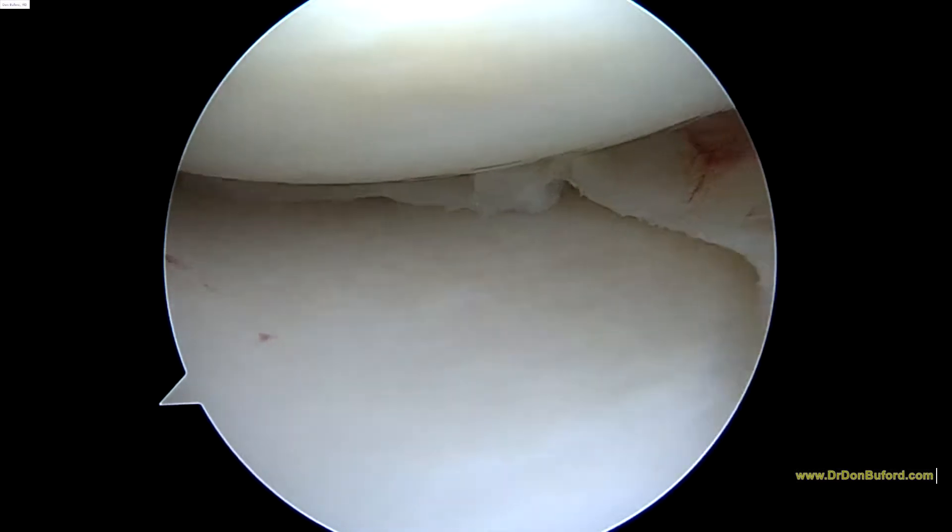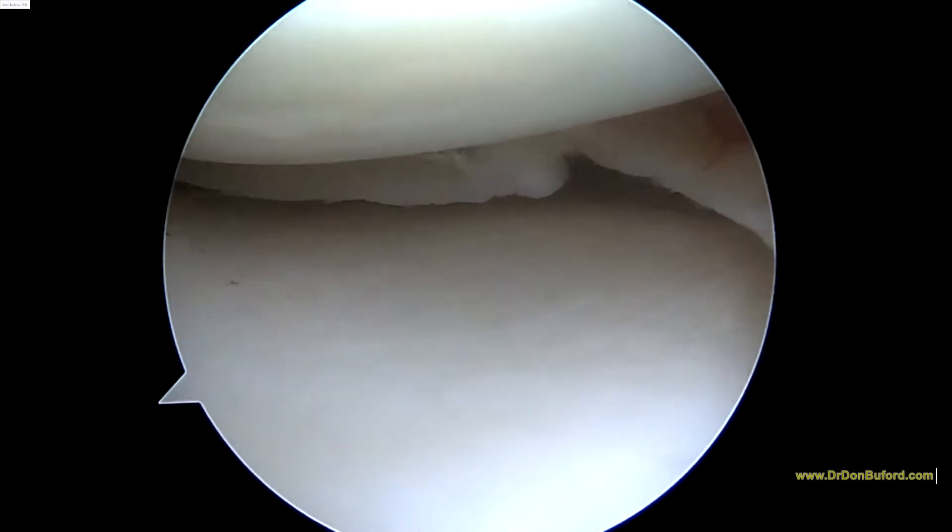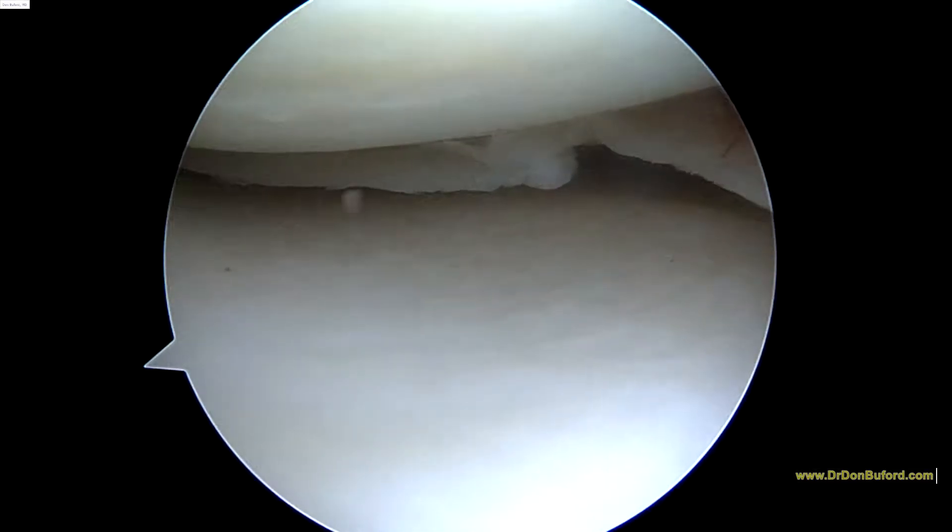Under right here, we're looking at the medial compartment. We can see here where the cartilage is. So we'll go ahead and make a little nick of the skin here on the medial side.